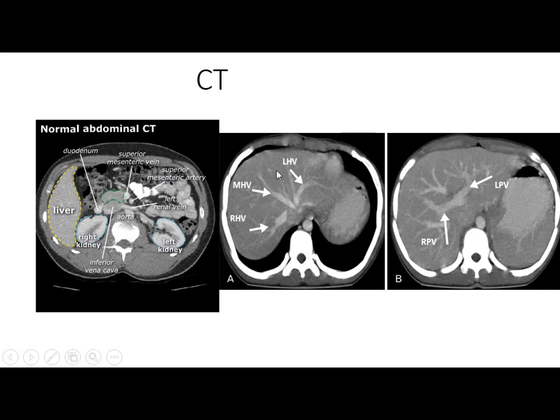What's next? The middle hepatic vein. 4A, and this superiorly. And then superiorly, segment 2 here, in the left. Excellent. Go a little bit down. Where is down? The portal vein, two of its branches are visible. So what do you see? Nearly segments 6 and 7 here. Good.